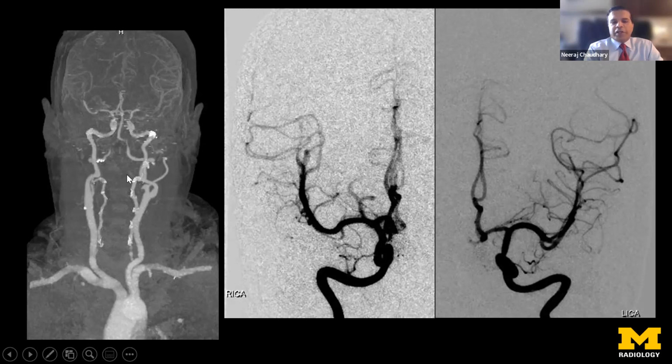of the brain circulation. So it's always important to go back to the source image to look at whether there is good opacification on the venous side, on the arterial side, to be able to assess that, oh, okay, this could be a false representation. And that is very important to convey to the clinicians, because we got this patient down for angiogram based on these images, and lo and behold, the vessels are nicely open. There is no spasm at all. So it's important to not overcall these situations.